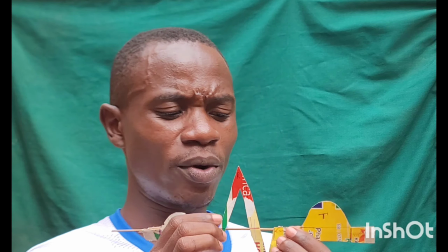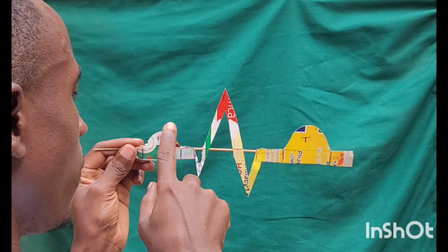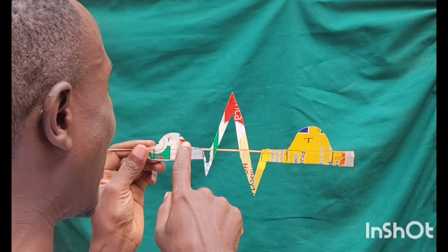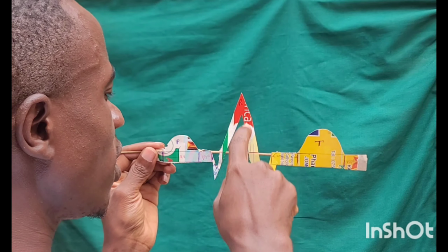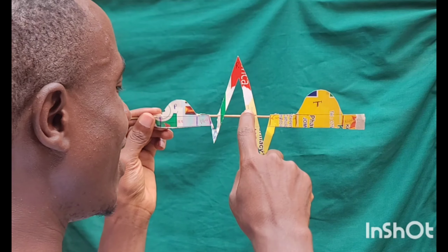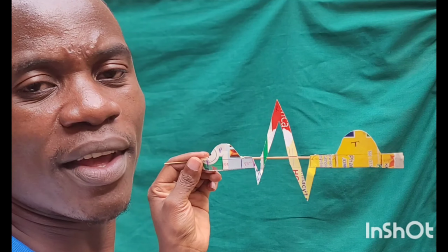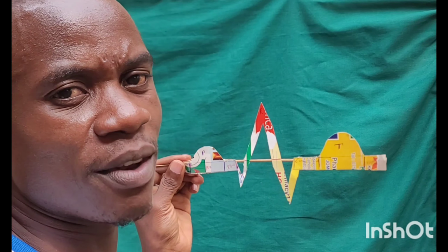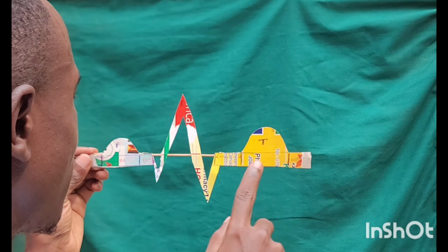Now, we are going to be looking at these wave patterns and see exactly how we call them. This wave here, which is a positive deflection, is what we call a P wave. Okay, and then this one here is a negative deflection, which we call the Q wave. Now, this one here, which is a positive deflection with the highest amplitude, is what we call the R wave. And then this one down here, a very, very important negative deflection, is what we call the S wave. And then the last one here is what we call the T wave, which is a positive deflection.